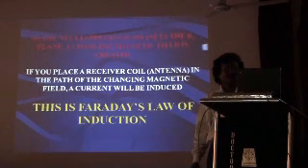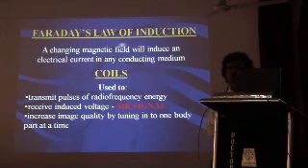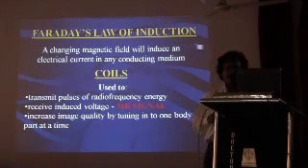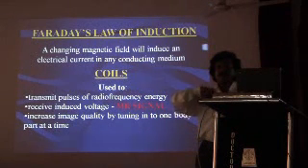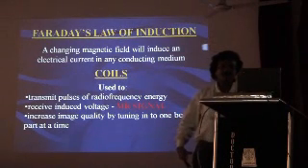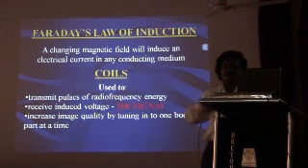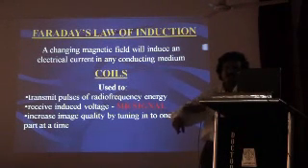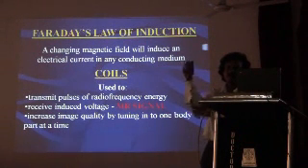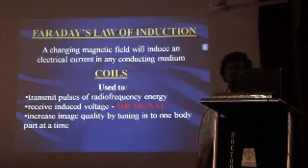So what are TR, T1 and T2? Now you have heard the names of the coils in the magnet. The body coils are basically radio frequency coils. Say for the lumbar spine there is a lumbar spine coil. For cardiac there is a specialized cardiac coil. For the arm there is a small part coil. For the brain there is a head coil.